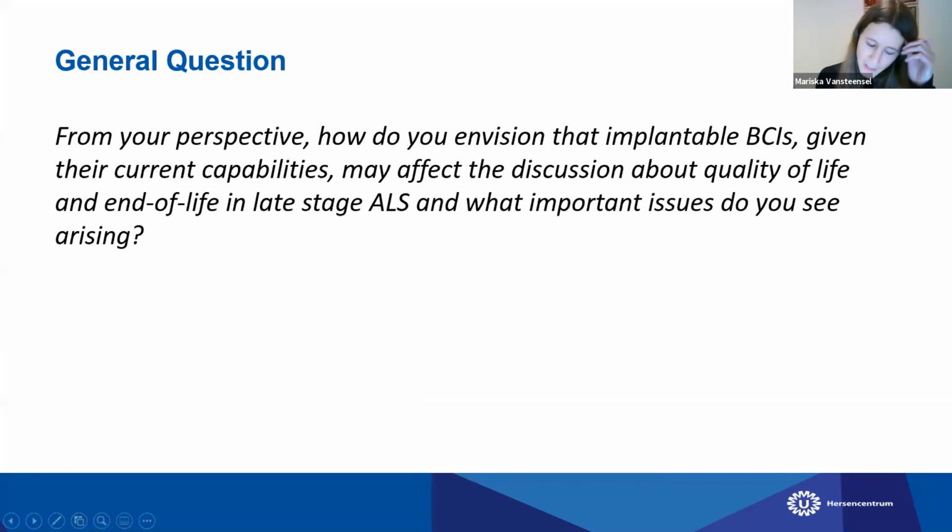Yes, thank you. I agree with a lot that has been said before, especially the statement by Dr. Simmons that if we would be able to develop and validate the implantable BCIs further and make them available to clinicians to offer to their patients as a way to retain some level of communication, would that affect the choices that people would make concerning life-sustaining technology, invasive and non-invasive ventilation? And this is especially important because also the BCI that we work with requires a surgery.